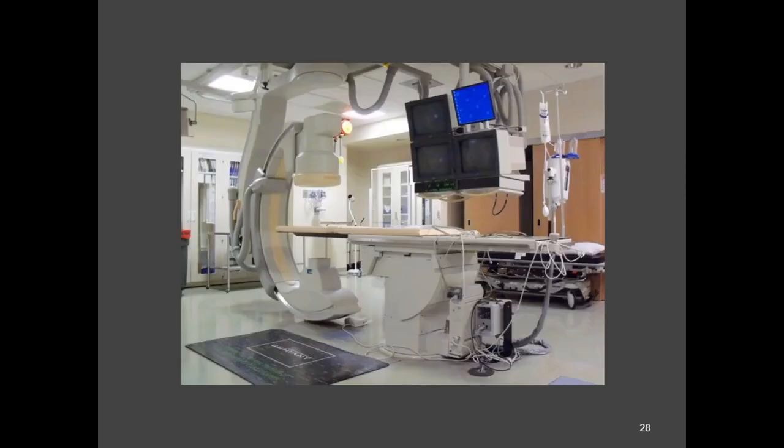And here's the vintage technology that people use with CCD. Even the CRs, like the 9900s, still use CCD cameras. This big box has the CCD camera, and again, this is probably about 2005, 2007 vintage. So you have the big old funky CRT still there, and you have the analog. But for the most part, I can vouch for it, the system itself was very reliable. It almost never broke. So even though it had older technology, it was a sweet system to keep going.